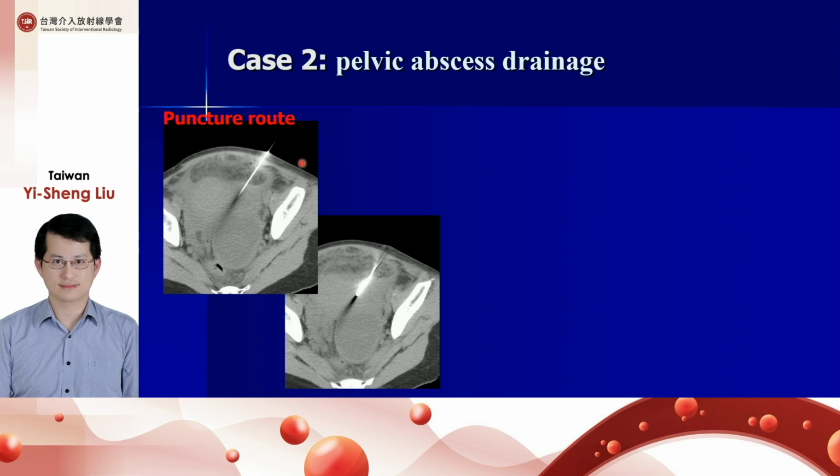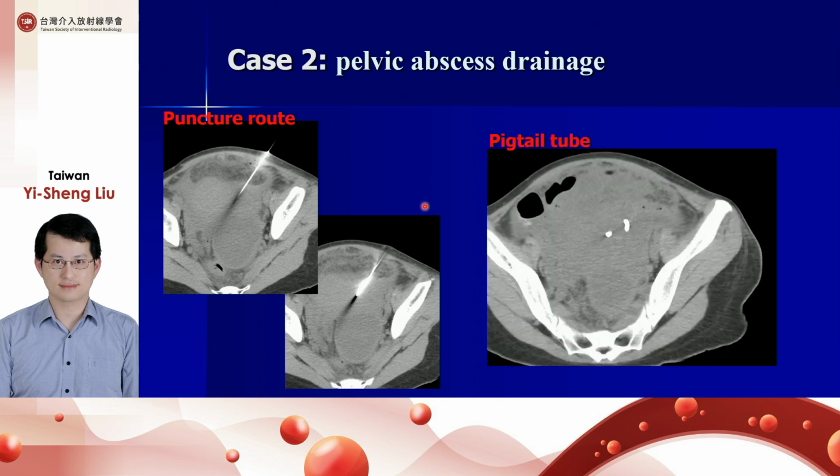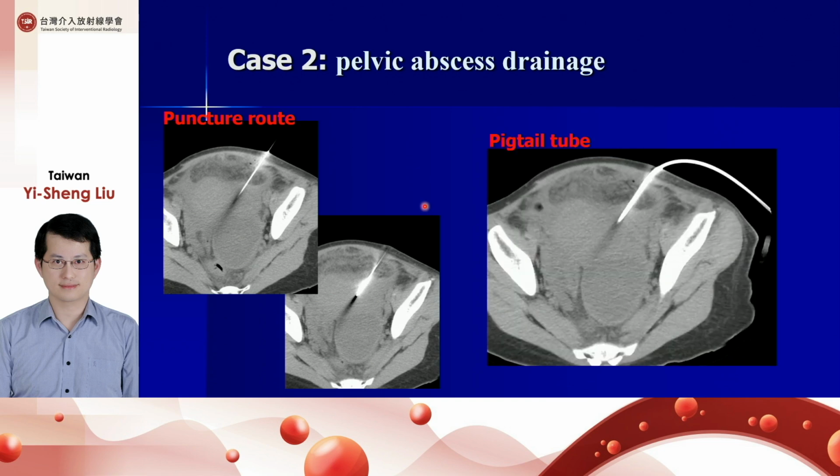And the feedback from the patient is also very important. If acute pain or discomfort occurs, it is thought the needle tip is too close to a bowel loop. After a couple of tries, we punctured the abscess smoothly, and the drainage tube was smoothly inserted. The patient recovered well after days.